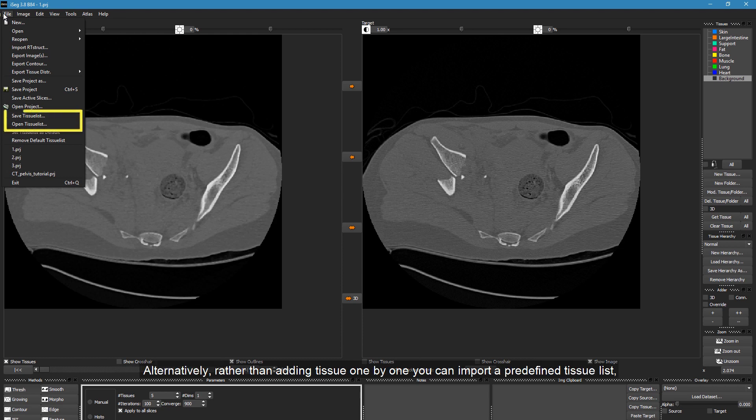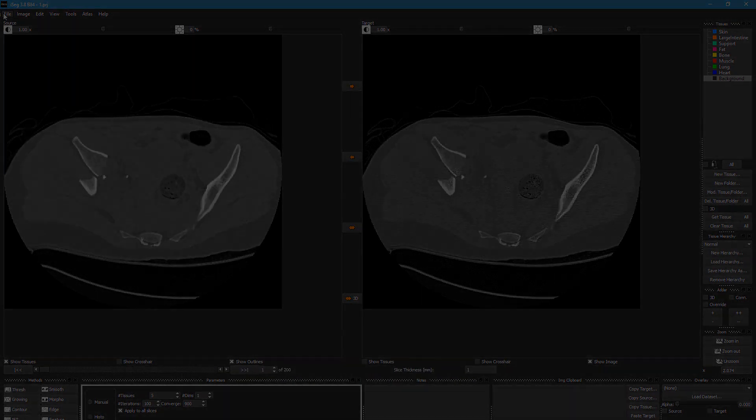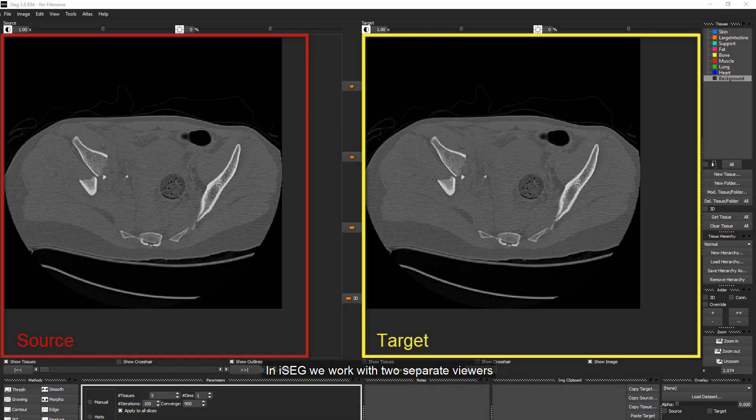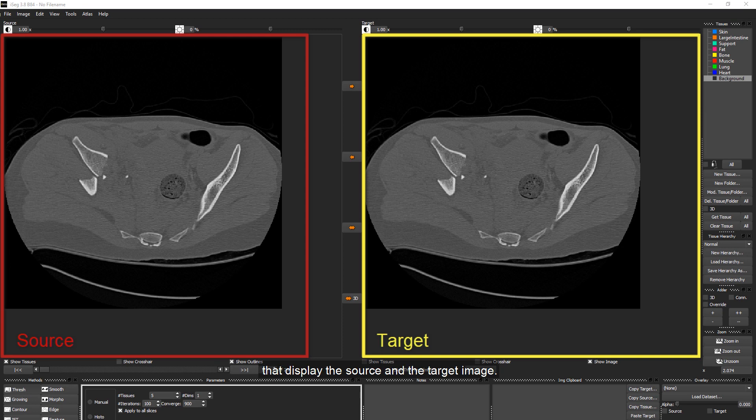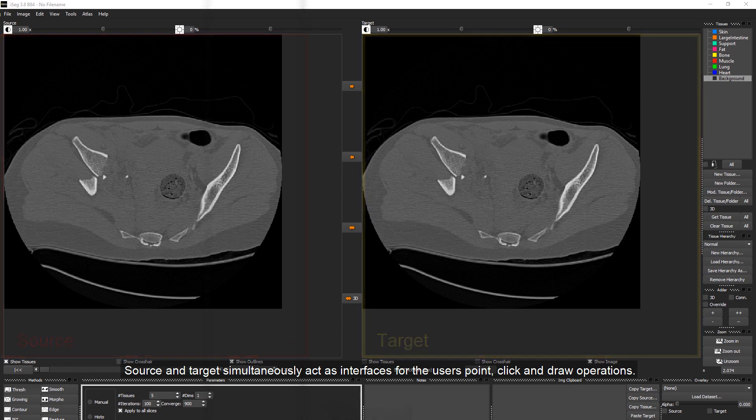Alternatively, rather than adding tissue one by one, you can import a predefined tissue list, which is especially useful if you are working with a large number of tissues. In iSEG we work with two separate viewers that display the source and the target image. Source and target simultaneously act as interfaces for the user's point, click and draw operations.